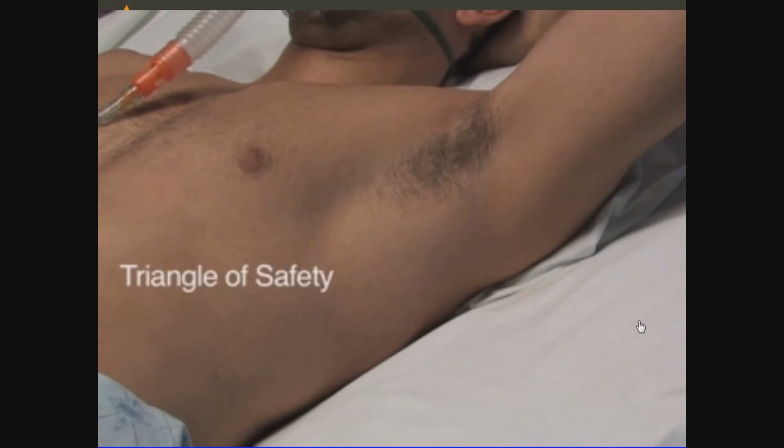The ideal location for the placement of the chest tube is in the triangle of safety, the anatomical region defined by the lateral border of the pectoralis major muscle anteriorly, the mid-axillary line posteriorly, which is also the anterior aspect of the latissimus dorsi, the apex just below the axilla, and the horizontal level of the nipple inferiorly. The nipple line may be an unreliable landmark for female patients due to breast tissue.